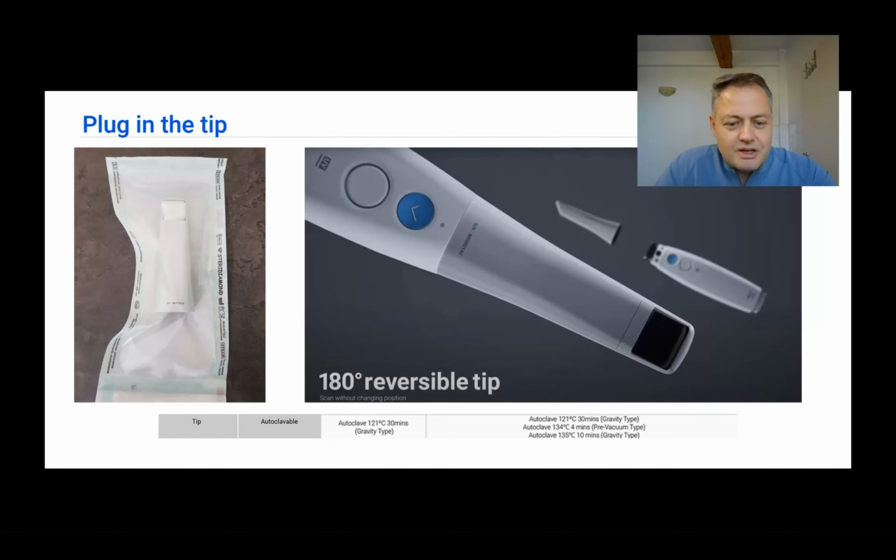After I wipe these tips clean, I dry them with sterile gauzes, and also place a sterile pellet inside the tip after I wipe the mirror clean, because when placing these tips in sterilization pouches, they can get little stains on them, and those stains are going to be a problem when scanning, because they can induce errors, or they are going to stop the scanning process.